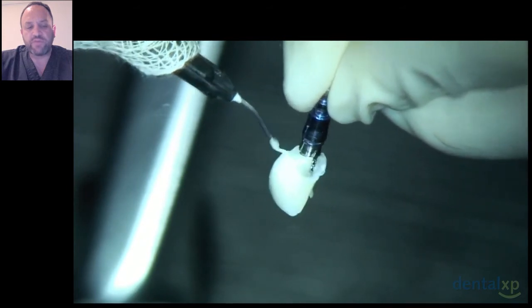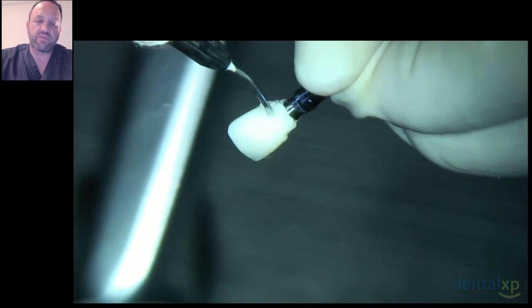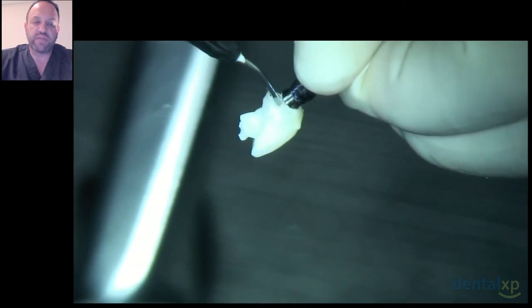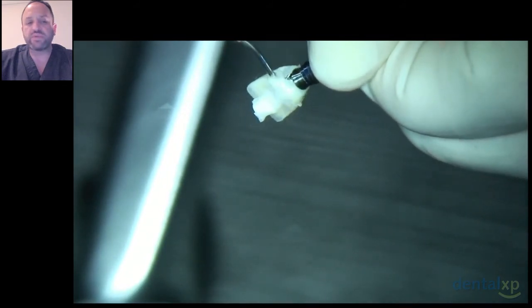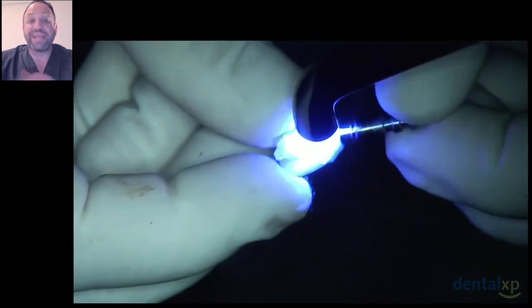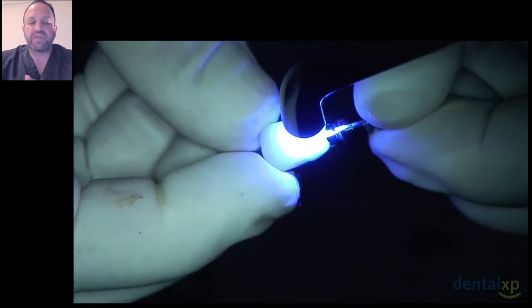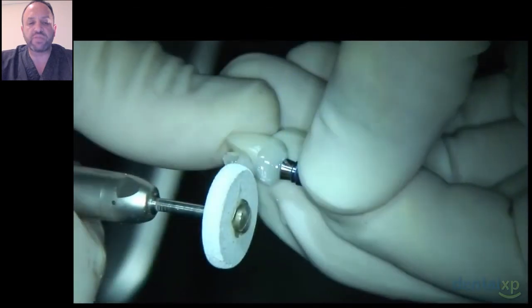You can add all the flowable composite in there. It's easy to add, easy to subtract. Getting the right colors, you've got a wide range of colors. And we're just adding all the flowable composite, then we'll cure it. And once it's been cured, we'll take a white rubber wheel and start to shape the crown. We'll start to create the S shape that we want to allow thick tissue to form between everything.